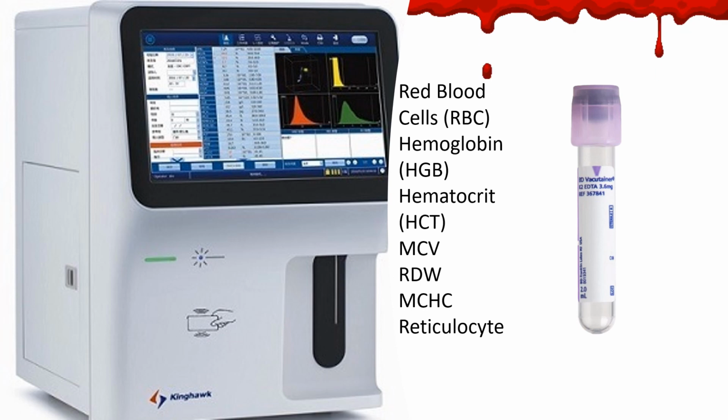But it's good for you to understand that if the person that is taking the blood is not following protocols, as we said, from the CLSI, found in the GP41, if the tube is not completely full, it's going to yield the wrong test result. If the blood test that is being drawn for you, if they didn't invert the tube in the normal angle, that will be a problem.